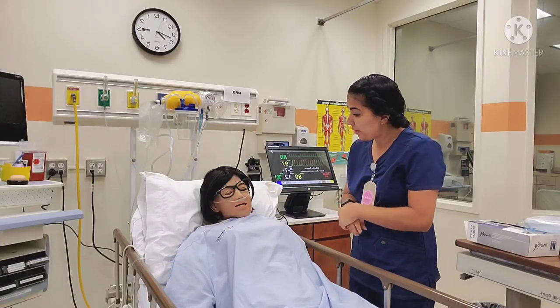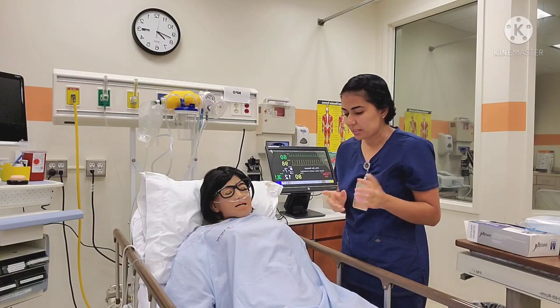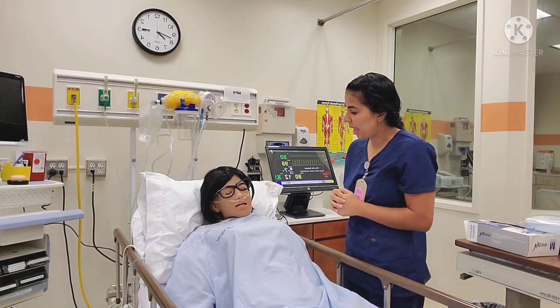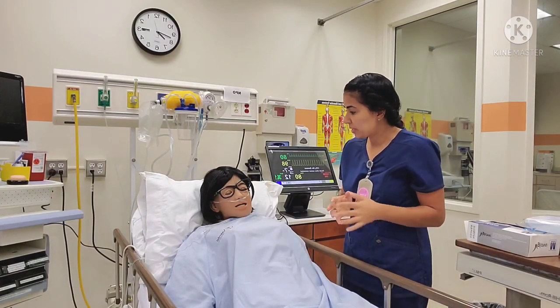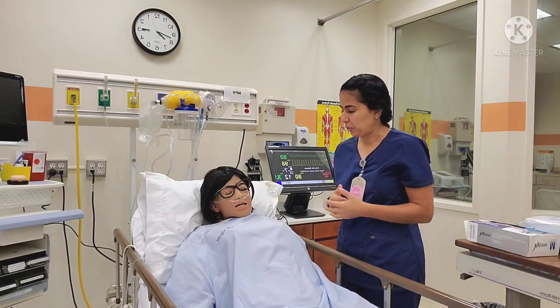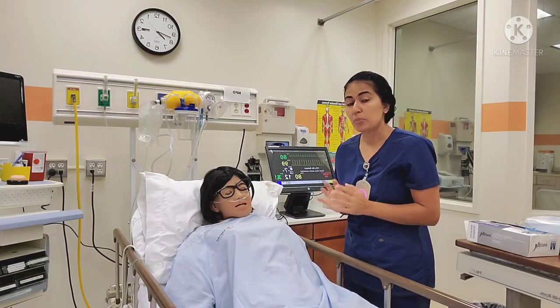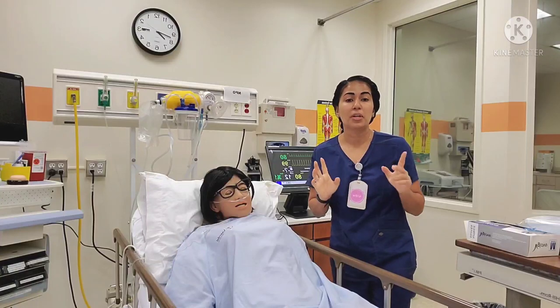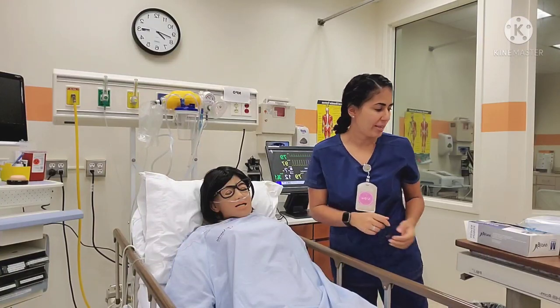Ms. Hill, the provider has ordered a urinary catheter — that's a catheter that's going to go into your bladder to drain the urine. It's going to allow us to measure it accurately. Is that all right? My patient says it's okay, so I'm going to go ahead and gather my supplies.